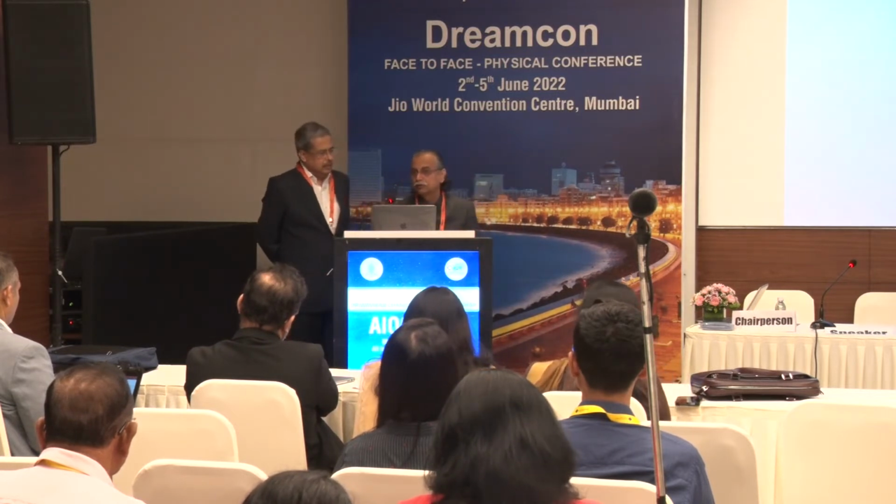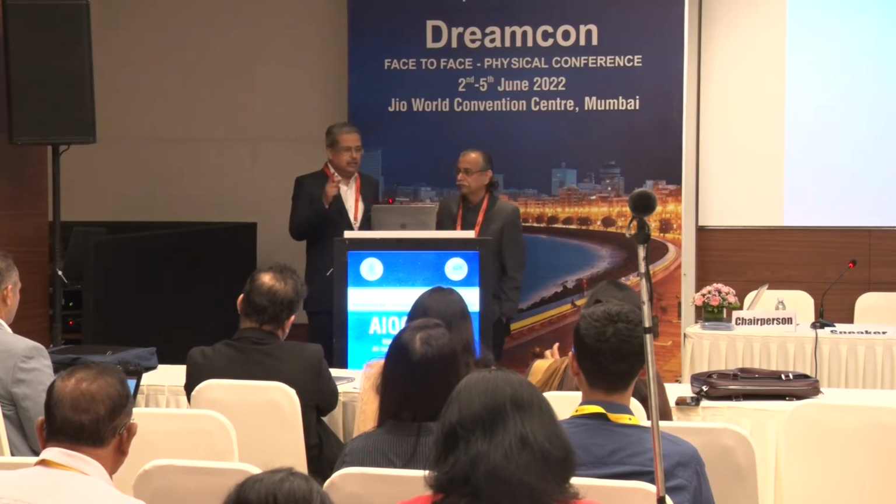Can I add one point? Construction of the wound is also very important. That's another thing I wanted to mention. You said sharp instruments. I would say that in a compromised cornea I'll use my sharpest knife, because I don't want any descemet's detachments to complicate matters. If you use a knife with which you struggle to go inside, be sure you are going to detach the Descemet's at some time, because so many instruments are going in and out. Another thing, as far as possible, don't take out the instrument when working on a compromised cornea. Do it in one shot. Try to finish the phaco in one shot.